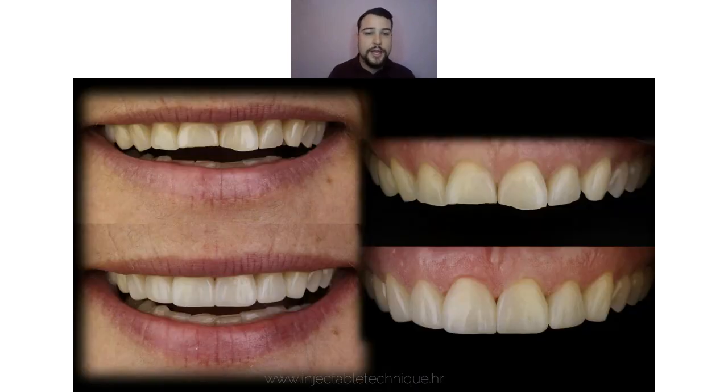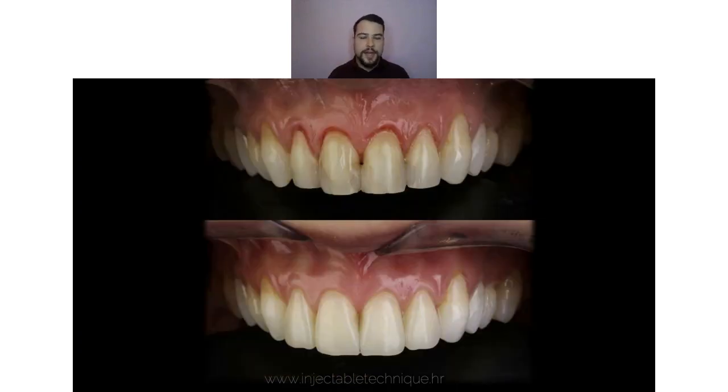Cases like I told you can be done very predictably, but we need to think about function before everything. If you don't have proper function, your veneers are not going to last. Most probably you ask yourselves, and I know all of your questions because I've been running this case for more than 2 years, I got quite a lot of those questions. Can we do it with interproximal cavities, interproximal caries, interproximal fillings? Yes, of course.